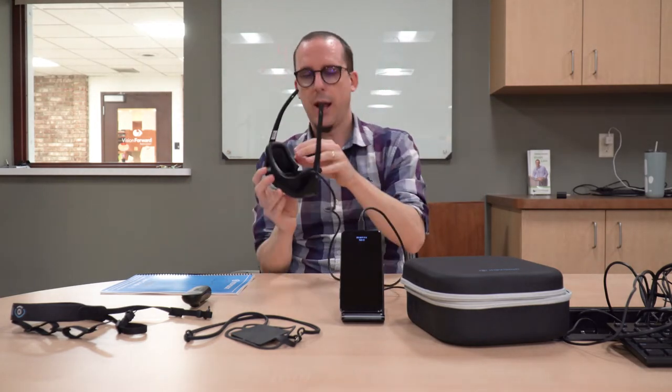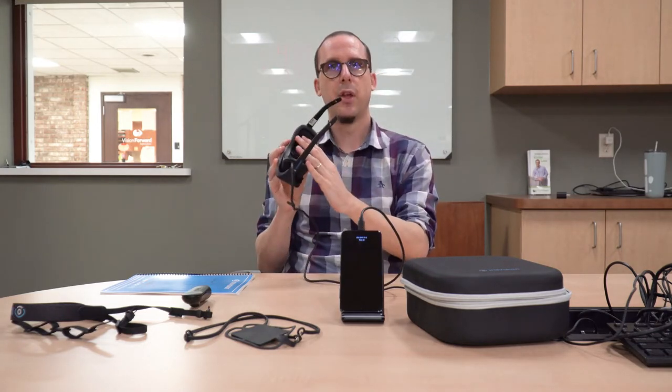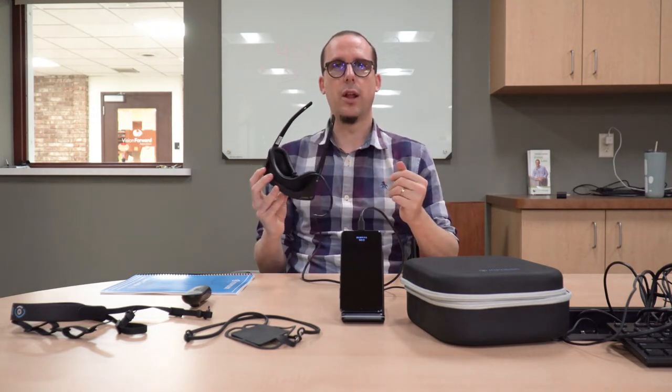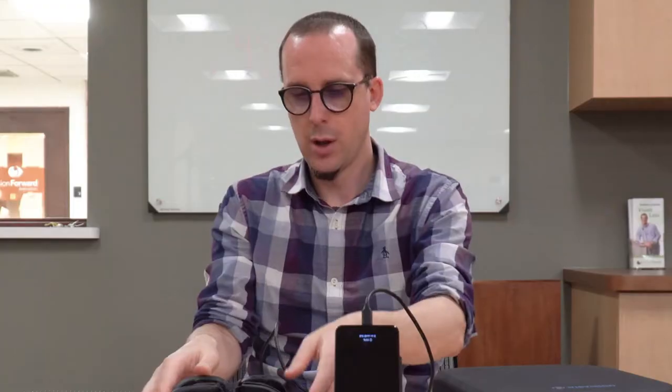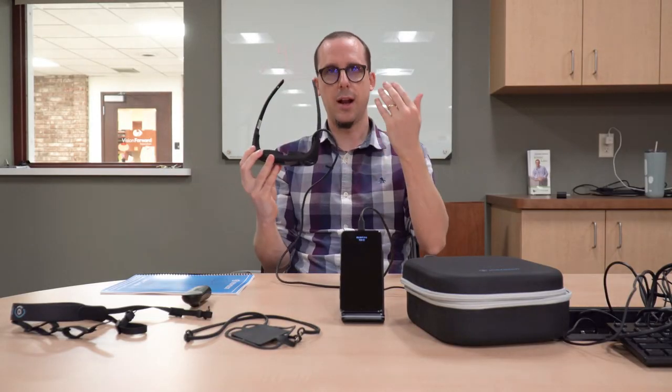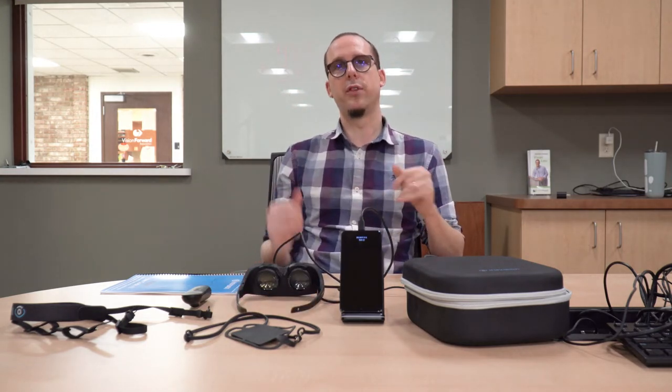Another neat thing about the design is we have this rubber insert that we can either have in or out. While it's in, it blocks off any external light so the headset is right up against our face and we're completely immersed in the screens. However, we can't walk while the rubber insert is in because we can't see anything around the glasses. With the IrisVision Inspire, we can pop that rubber insert out, and when wearing the glasses we can see around the periphery - around the edges - which allows us to be mobile with this device.